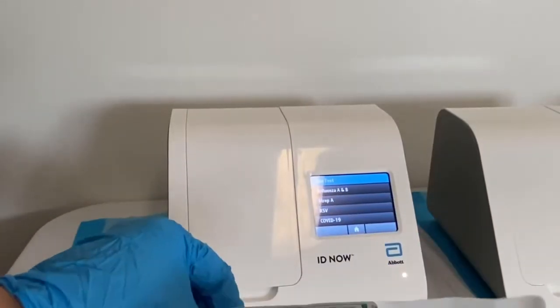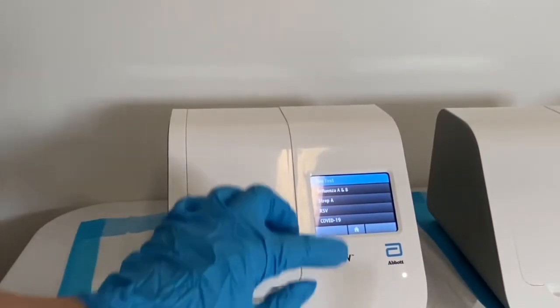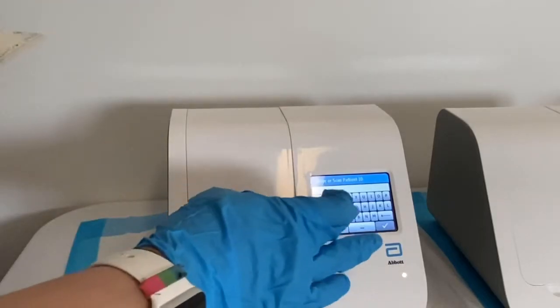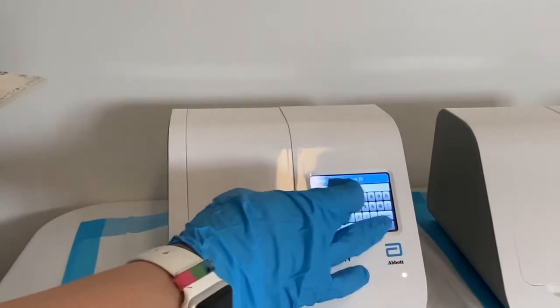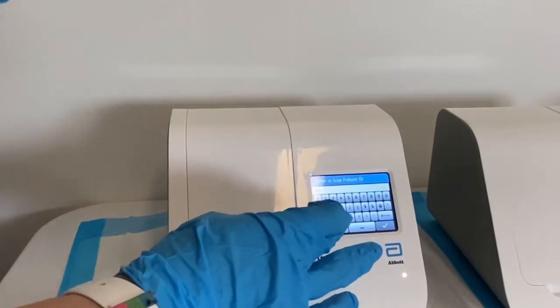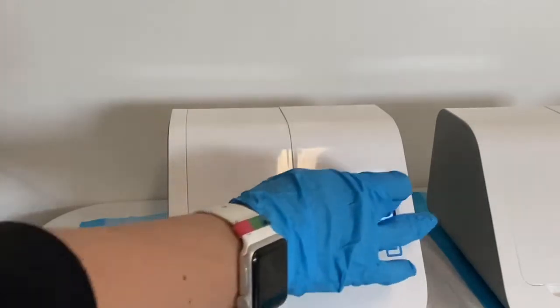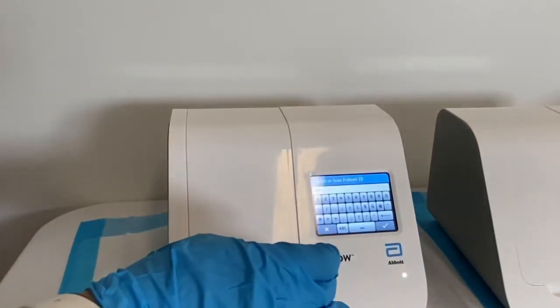First off, we're gonna have your sample. When the machine prompts you, go ahead and place the patient identifier here — we're gonna place the MRN number. It could be the patient's birthday, first and last name, etc. I'm gonna have to block this out due to HIPAA, of course.